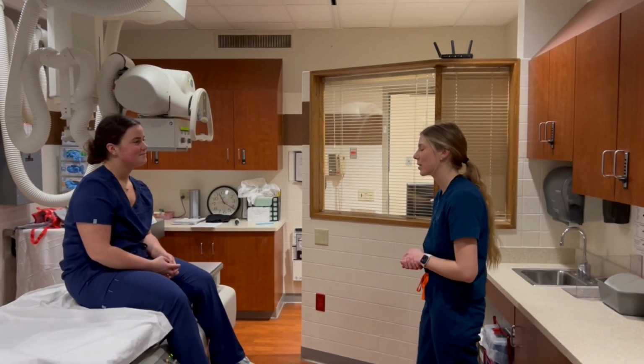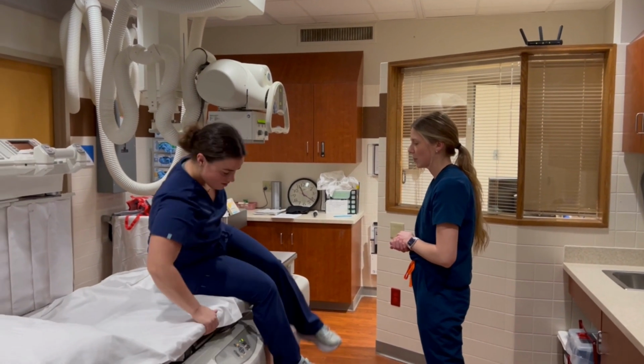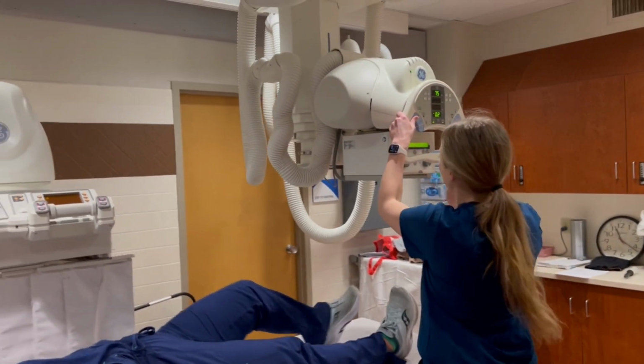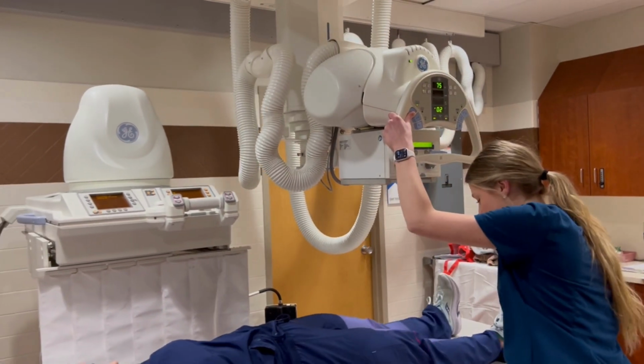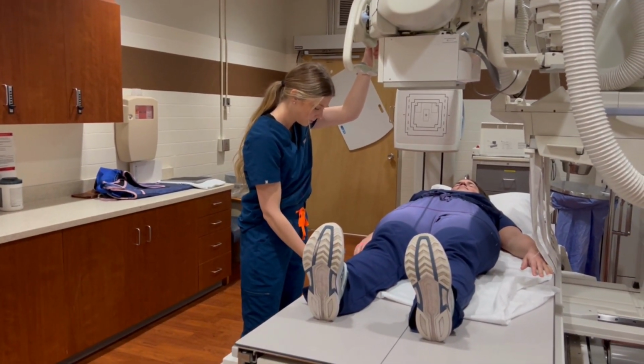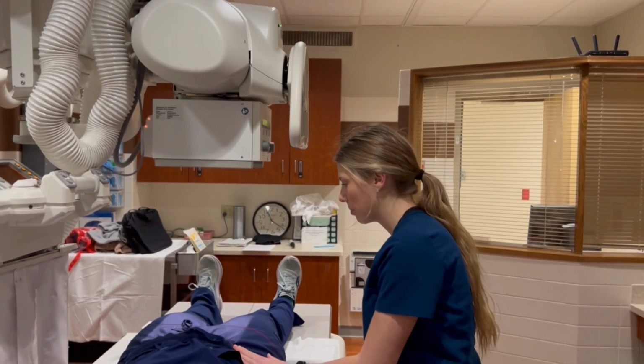Alright, Ms. Jackson, so we're going to be taking x-rays of your right hip, so I'll have you lie on your back, relax your legs. This tube is going to be coming above you. Alright, the table's going to be moving. I'm going to be poking in your hip a little bit.